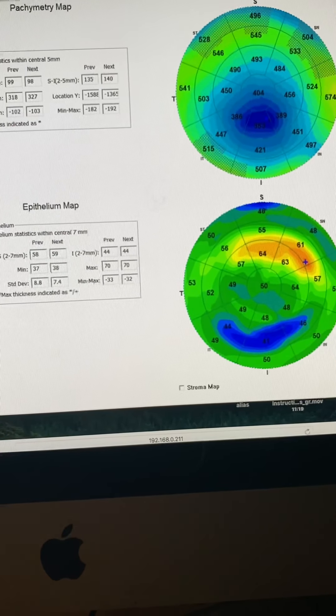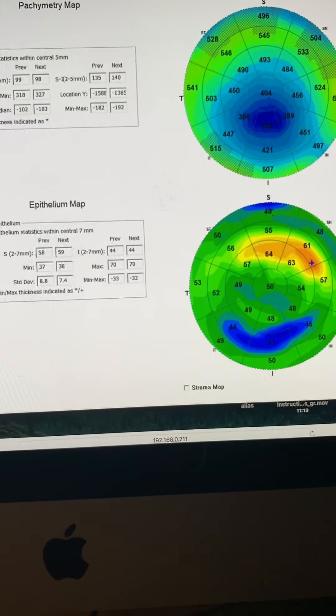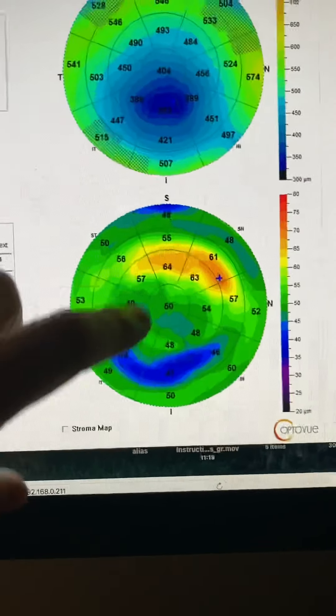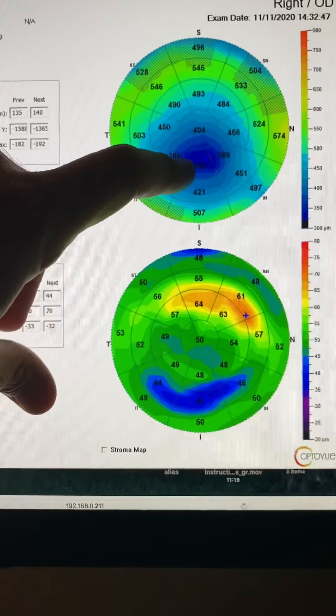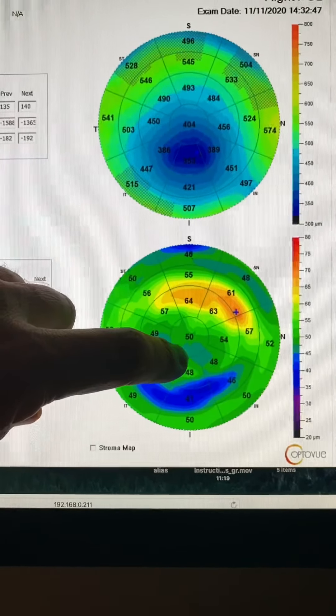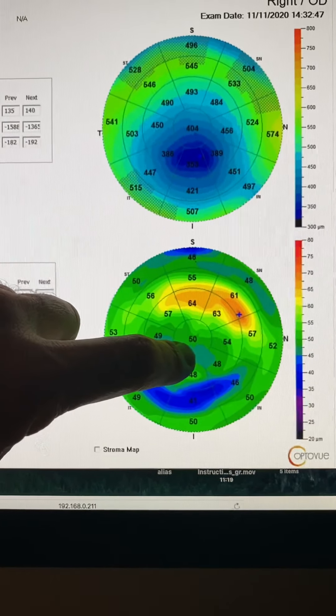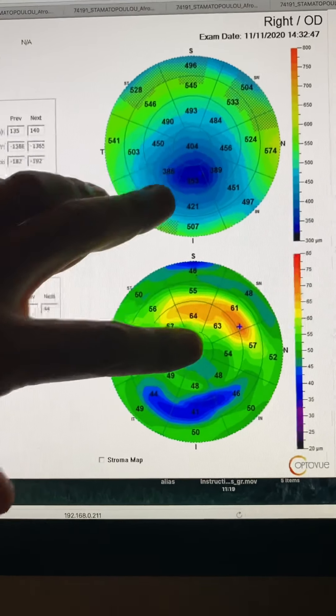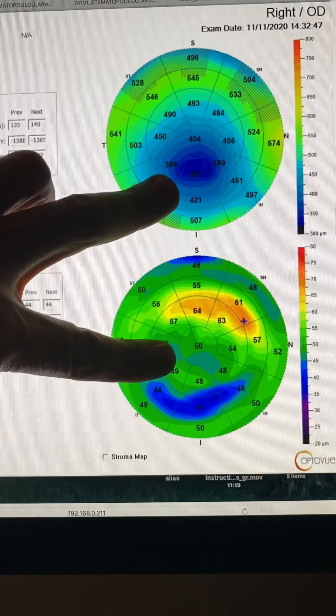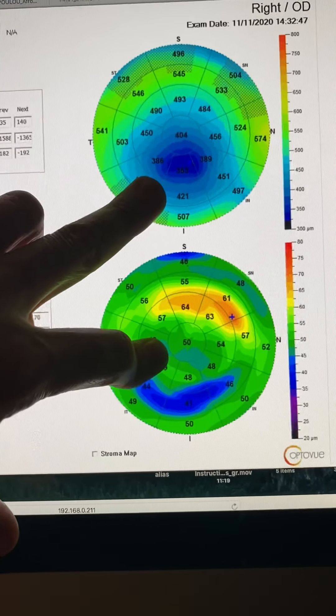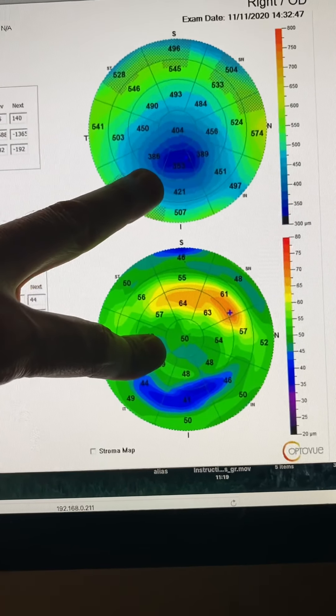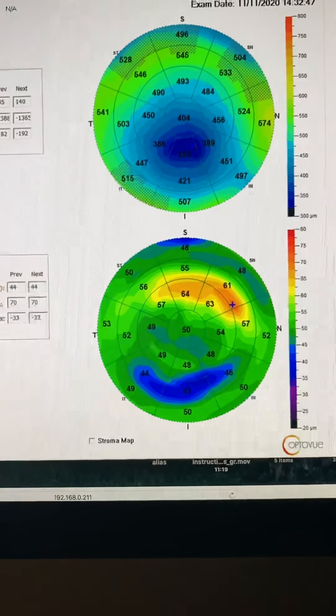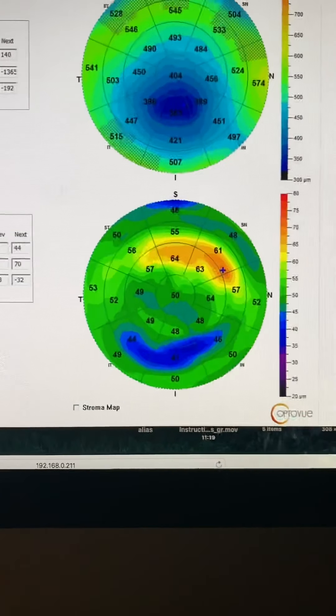This is why the cornea has changed. And for us, the fact that the epithelium is quite thick over the thinnest part of the cornea, we've talked about this before, the fact that the keratoconus is inactive. So a good sign here.